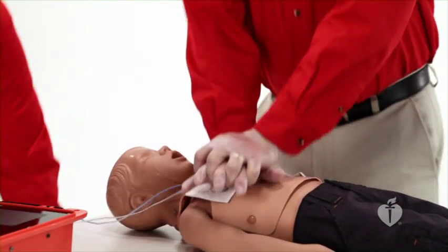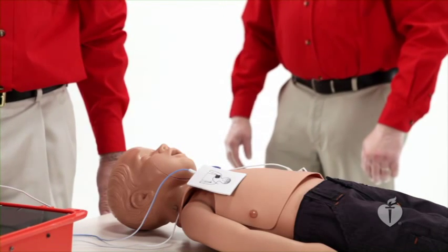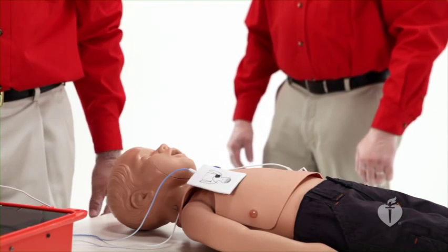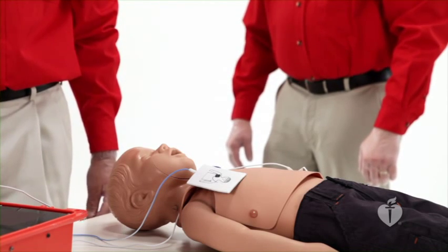Plug in pads connector next to flashing light. Clear. Analyzing heart rhythm. Do not touch the patient. Shock needed. Charging. Stay clear of patient. Press the flashing button now. Clear to shock on 3.